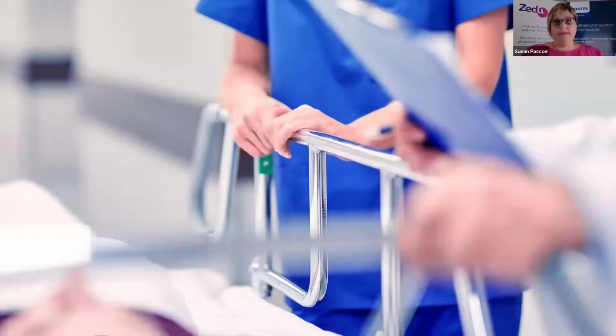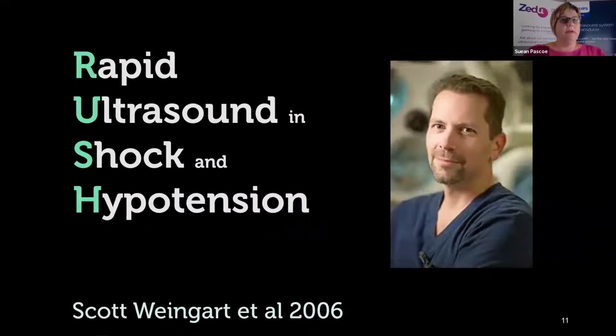But when you're at the bedside, with a lot of those signs and symptoms from all those various different types of shock, there can be quite a lot of overlap, and it can be quite hard to know which way to go. So along came Scott Weingart.